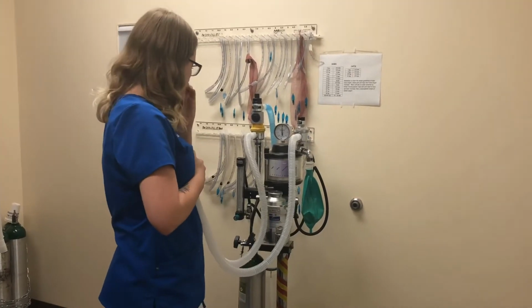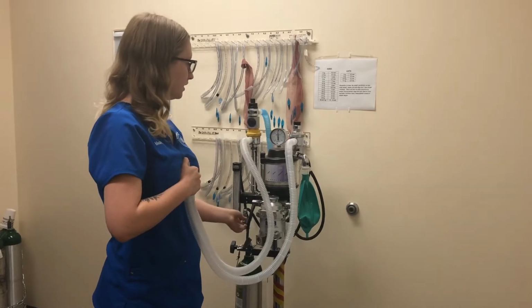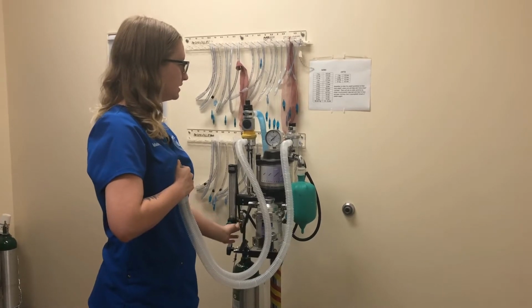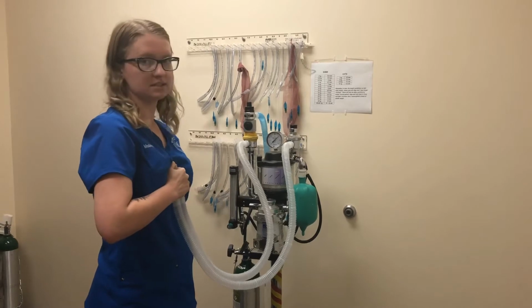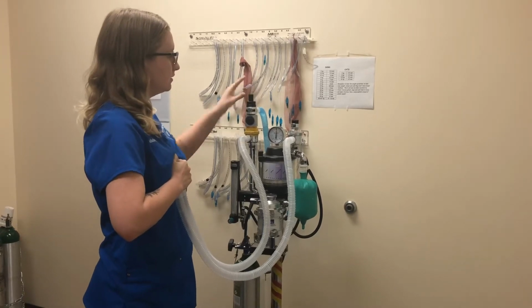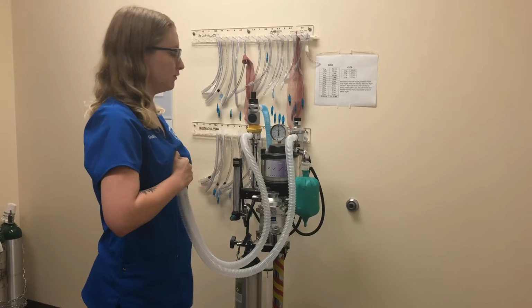Then we'll flush some oxygen through on the O2 valve until the manometer reads 20, which is centimeters of water. You want it to read 20 and stay at 20, which it's doing, so that means there are no leaks in the system at all. Then I'll open the pop-off valve back up, and it goes to 0, so that means everything has escaped the system and it's able to leave and not have pressure build up.